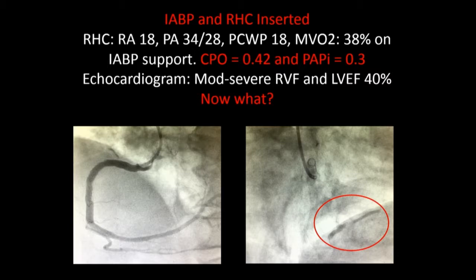Okay, so we've got a balloon pump, you've got these hemodynamics, and so we've heard about Bipella. What else could you do for this gentleman? You could do a septostomy, which is a very interesting concept. So septostomies, I think it's an important point to bring up. So these are passive pop-off valves for the right atrium. Your RA to wedge pressure ratio is 1.